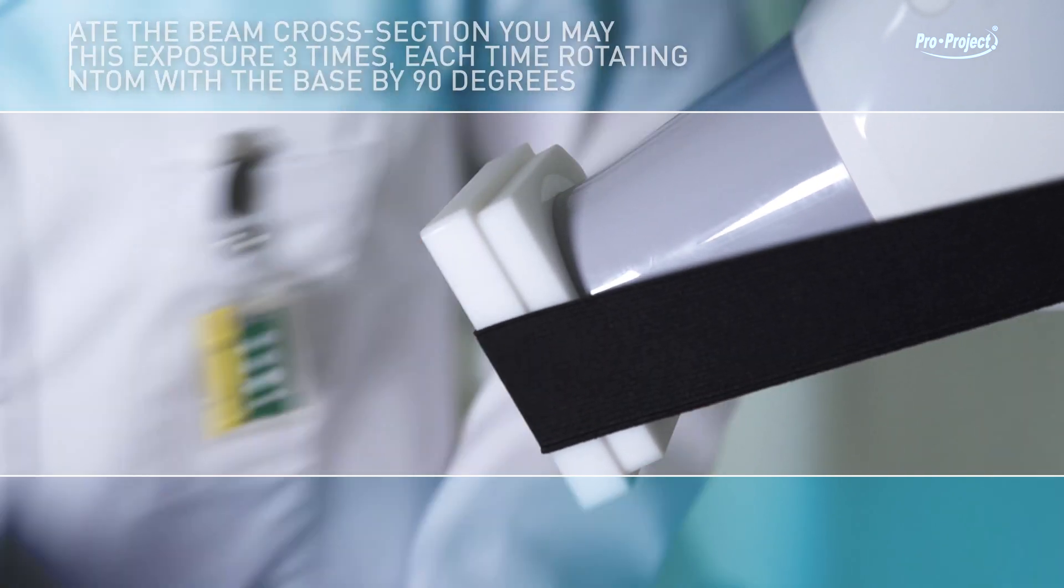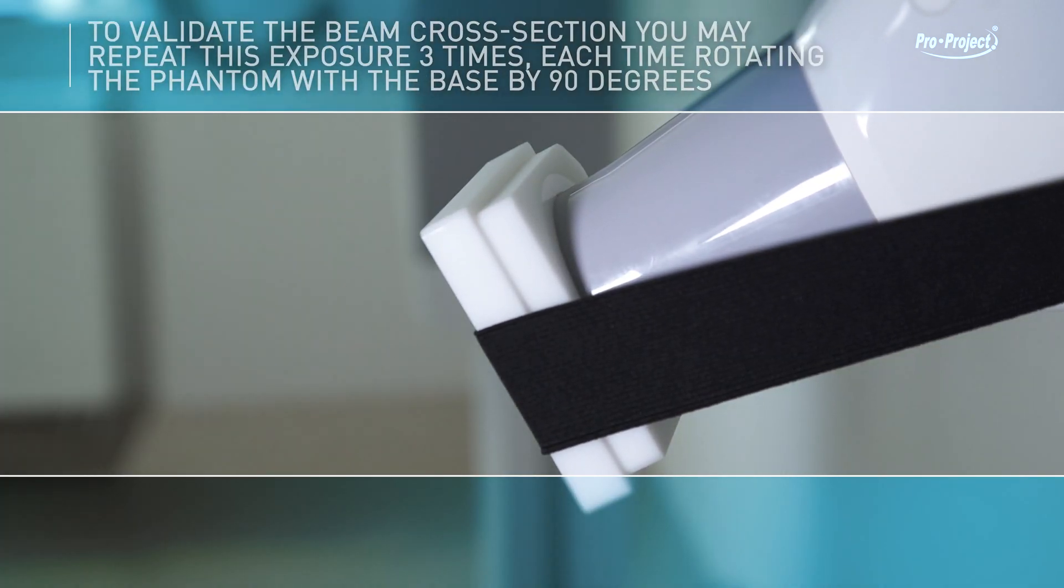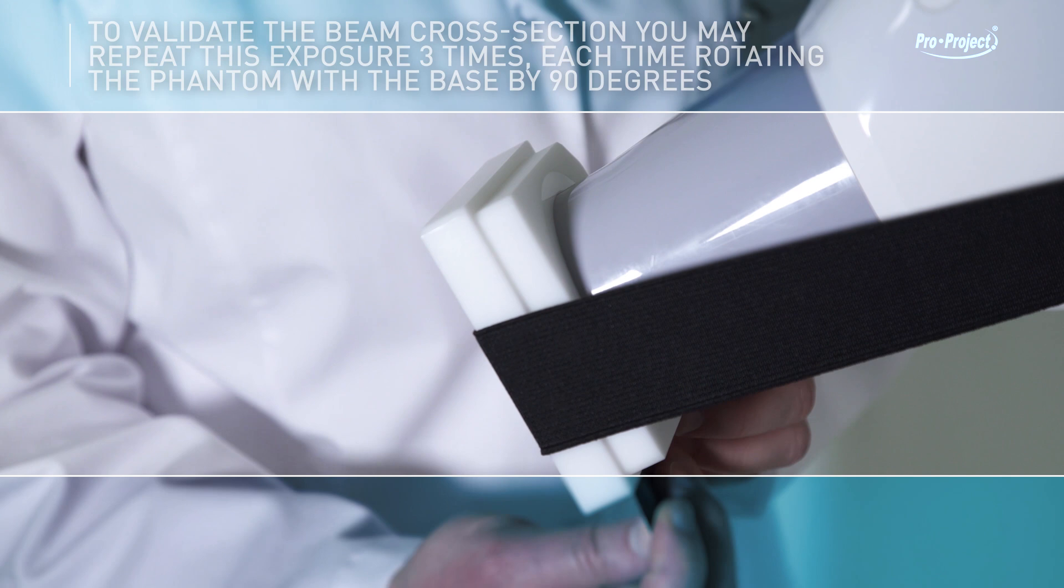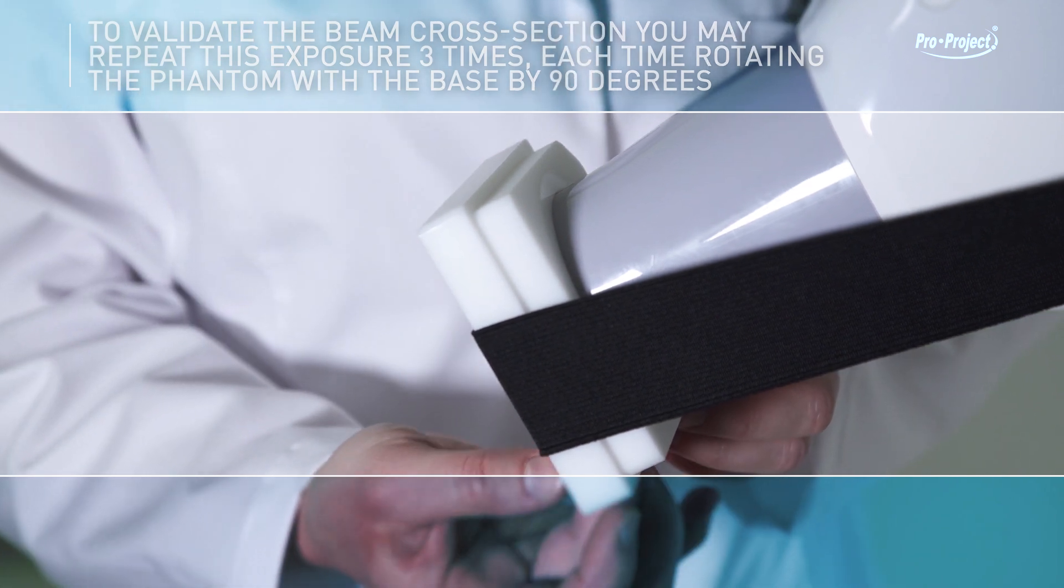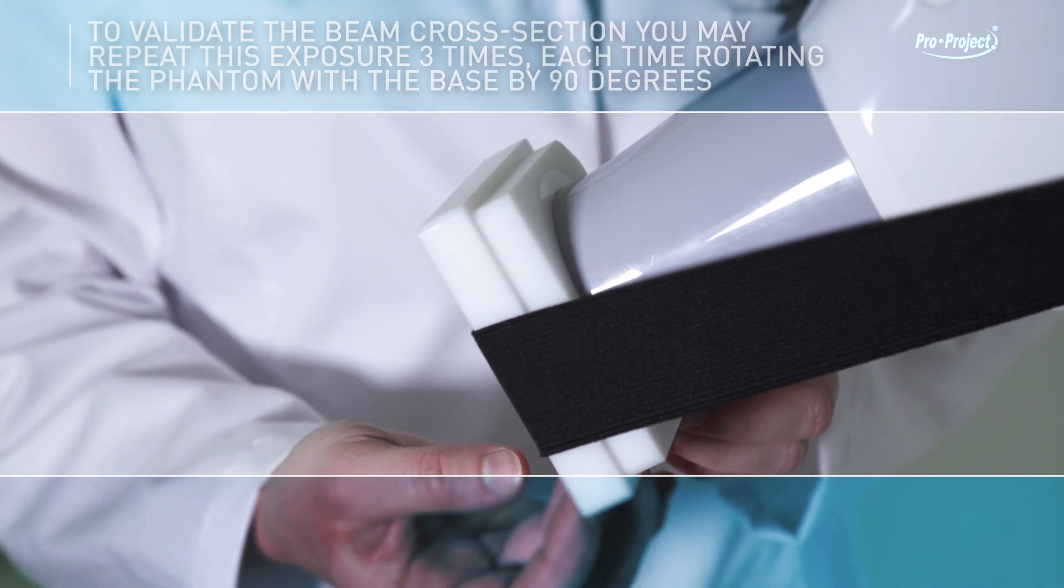To validate the beam cross-section, you may repeat this exposure three times, each time rotating the phantom with the base by 90 degrees.